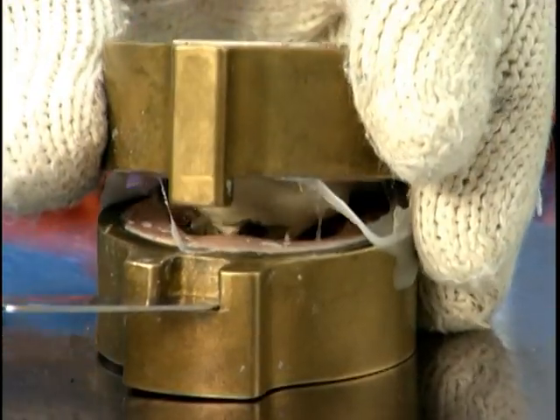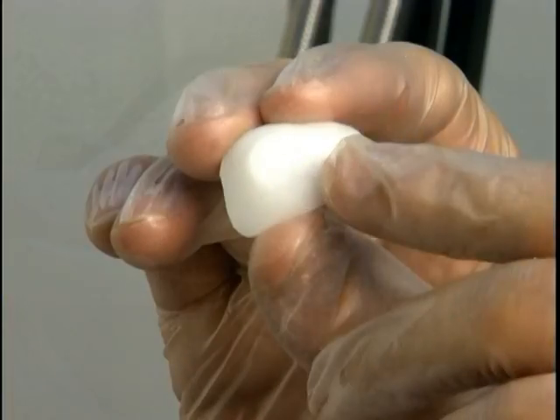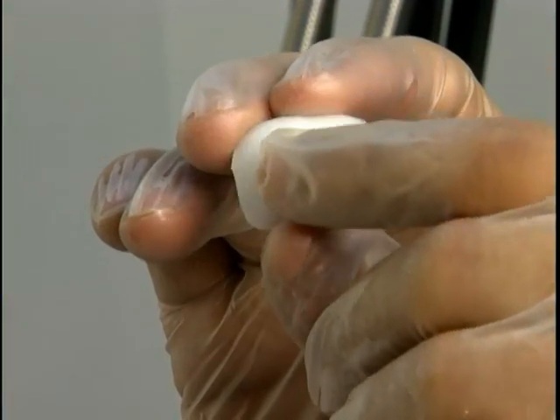After 35 minutes, open the mold and remove the clay and iris button to expose the scleral blank. Now you have your blank canvas in which to paint.